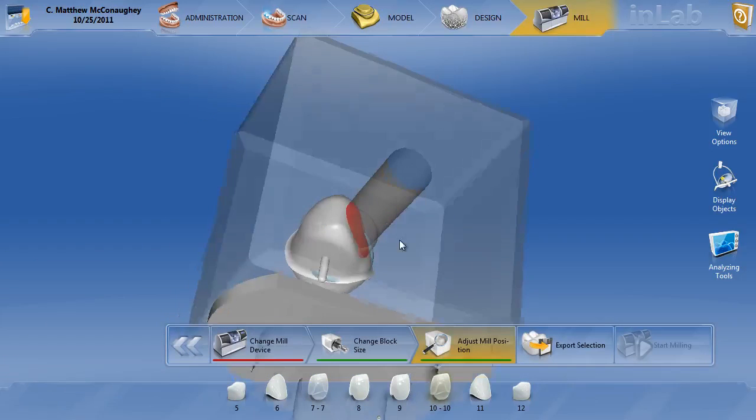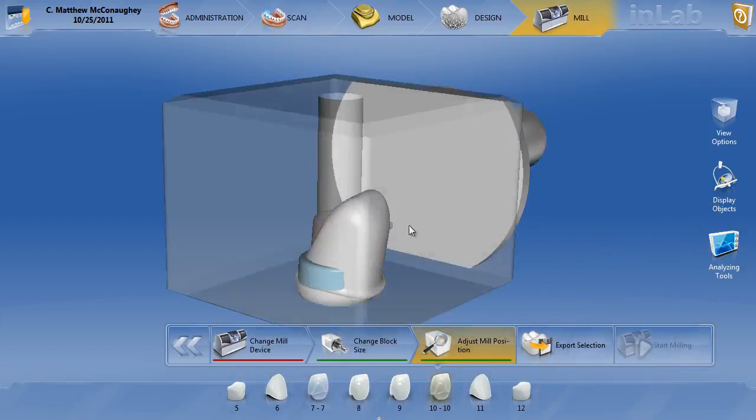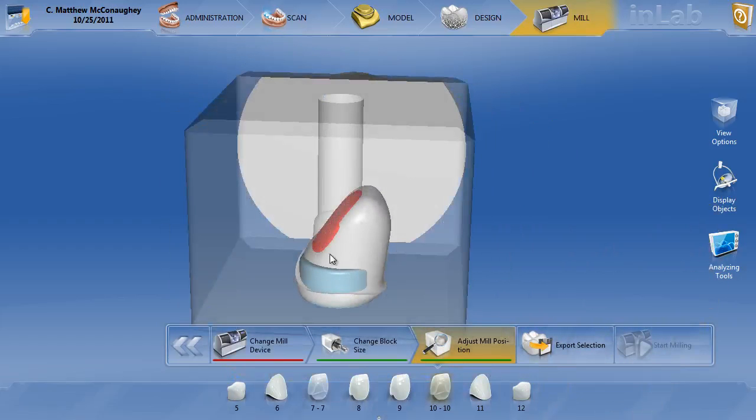Hopefully this helps — a rough idea on how to handle a case like this. It's going to take a little design work, but you're also going to have the titanium base sticking out the backside of this abutment. You're going to have to take a burr, mill it flat, go ahead and put that back on the model, and re-image for the final crown.